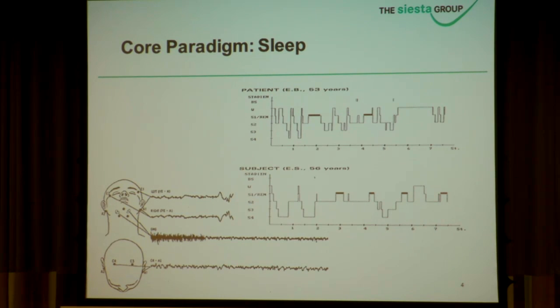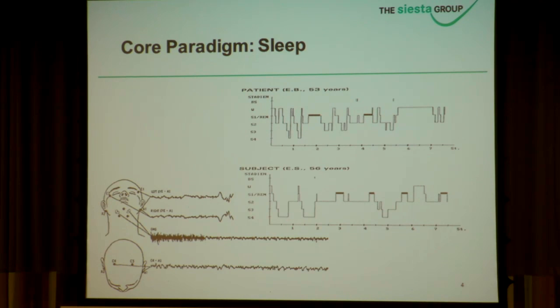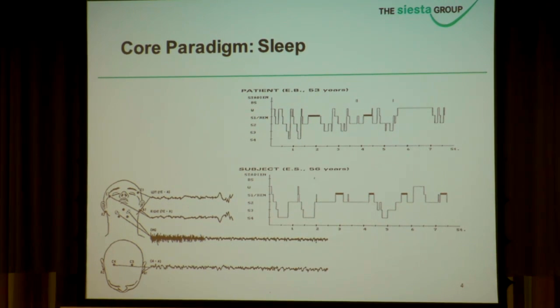I would also include sleep in EEG analysis. Sleep polysomnography contains EEG, as many of you know, as a main component. The typical way of analyzing it is dividing the night into sleep stages and then deriving parameters from that. I think we'll hear more about sleep a little later. But also, and that's an interesting intersection with the other parts of EEG, you can use sleep EEG as a kind of stable biomarker for PD-PK modeling, for instance, when a drug is taken in the evening.